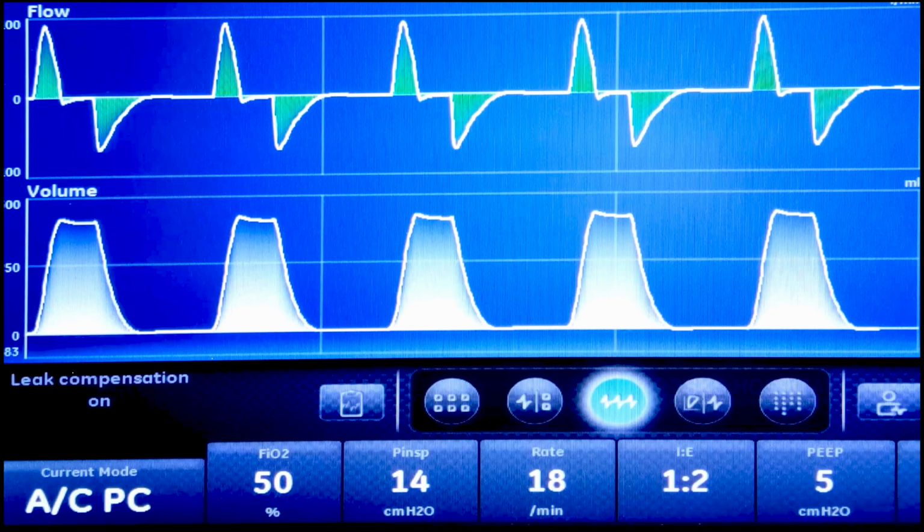But having said that, there is no strong clinical data to support it or to show that it is better in terms of ventilation or such other things. But certainly there is a theoretical advantage of using deceleration flow, and that is why the peak pressure, and of course the fact that you have a limitation on the peak pressure, there is some degree of lung protection in that sense.